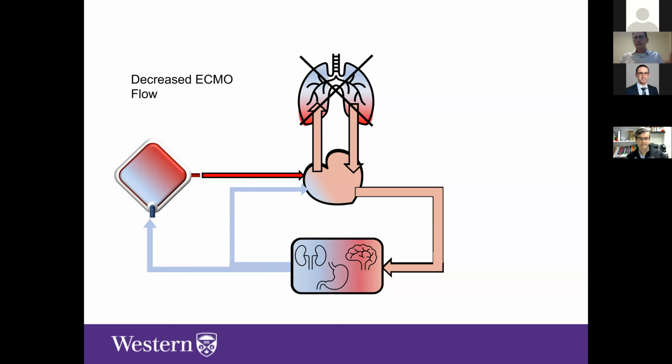So one way that SATs can be affected is by decreasing flow through the pump. And this is assuming everything else is working correctly, right? Like the oxygenator's working, the FiO2's on, all that.